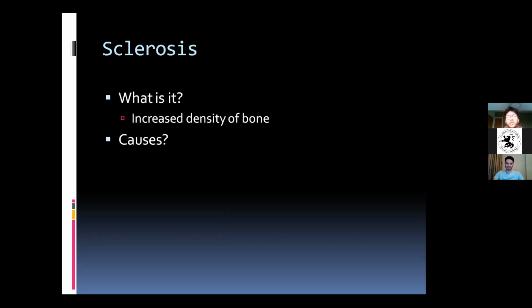I just say, oh yes, you know what, there's definitely prostate cancer. Think about all the other things that can possibly cause it. Yep, inflammation. Well done. And I think you mentioned this before as well, which is osteomyelitis. But there are two different types of osteomyelitis. What kind of osteomyelitis in this case will cause sclerosis? Good. Chronic osteomyelitis is what can cause sclerosis. The other, acute osteomyelitis, will cause a lytic lesion instead. That is a key difference.